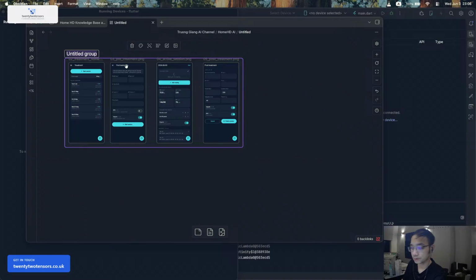It needs to be able to start a session, know if there is a session that is ongoing, and input the session information or add the reading to it. And it needs to be able to get the session information, right? So it needs to be like this.